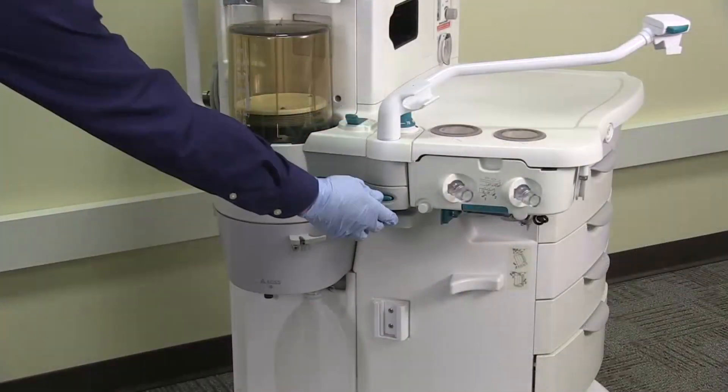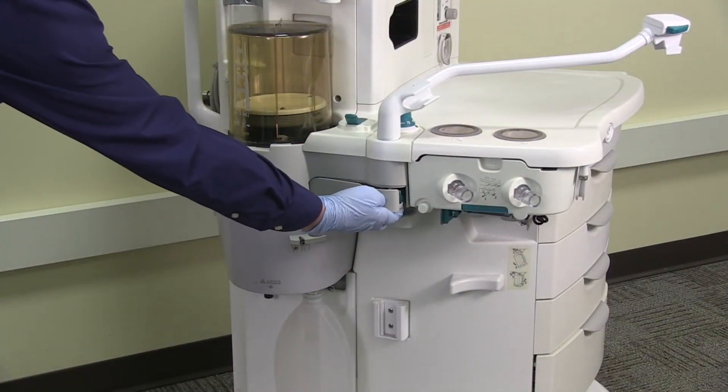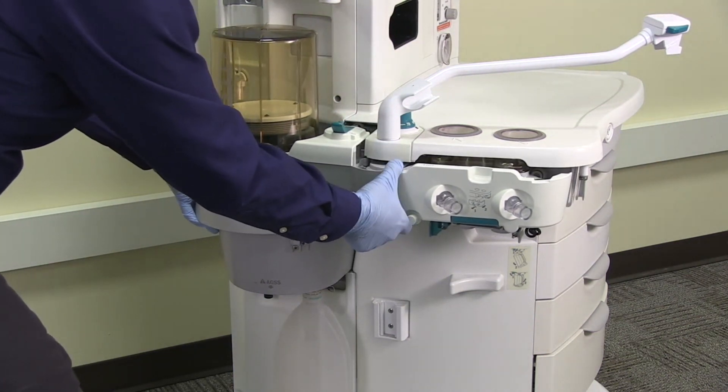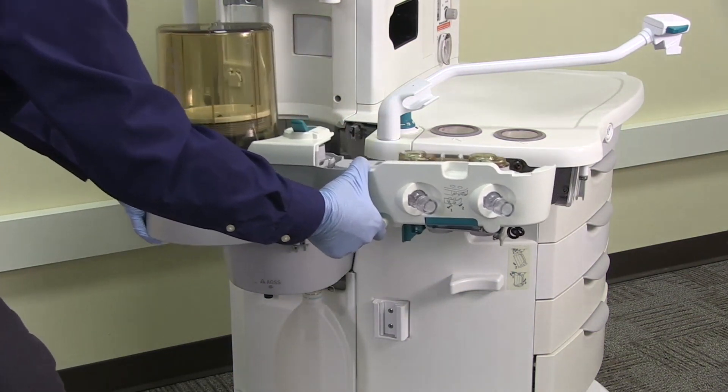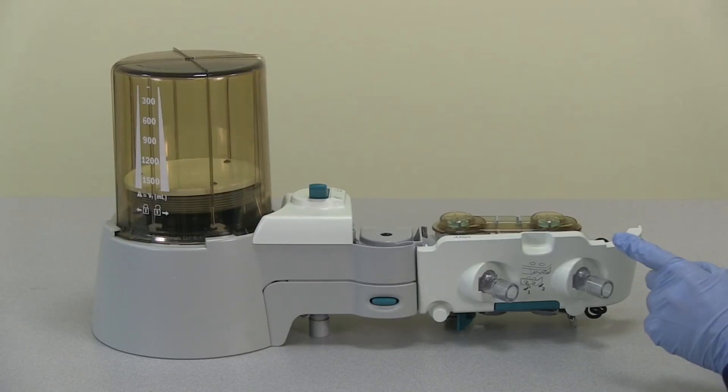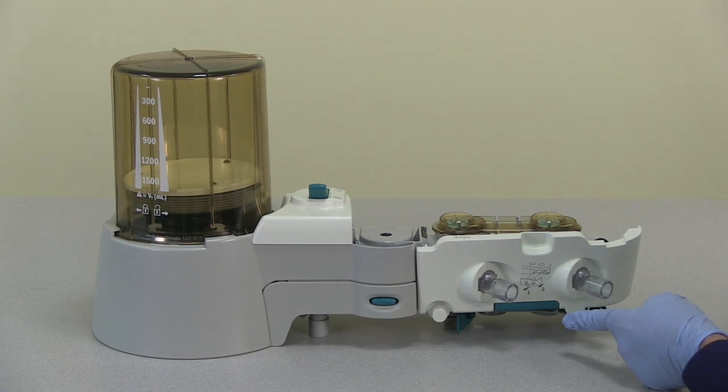To remove the breathing system, push the release button and gently pull the latch handle to release the breathing system. Grasp the rear handle to support the breathing system and slide the breathing system away from the workstation by pulling under the latch head. Place the breathing system upright on a flat surface.